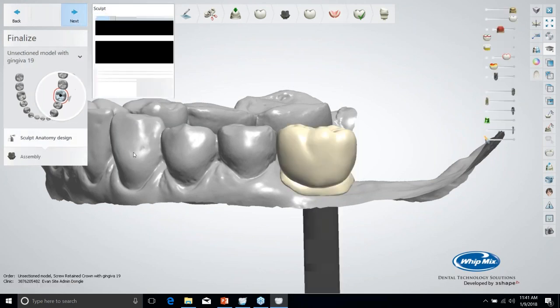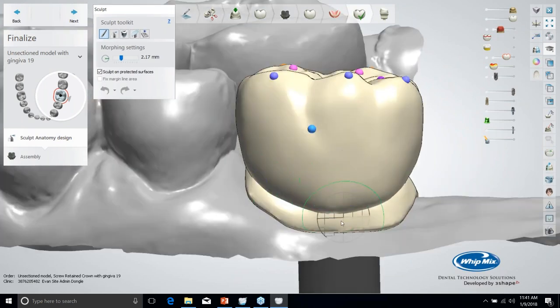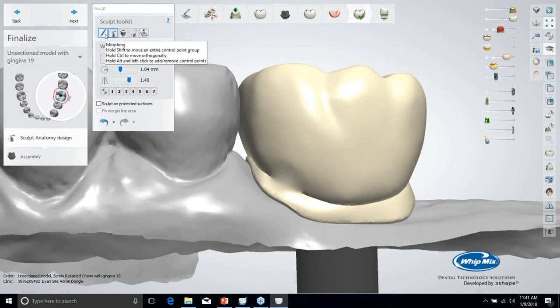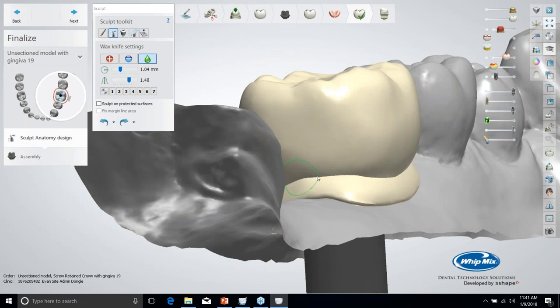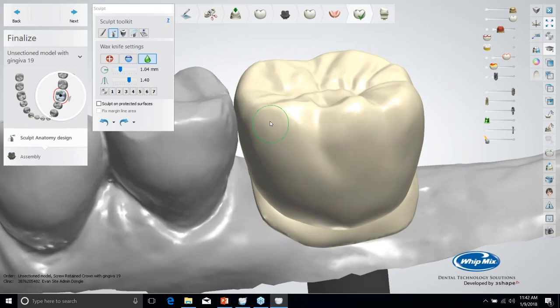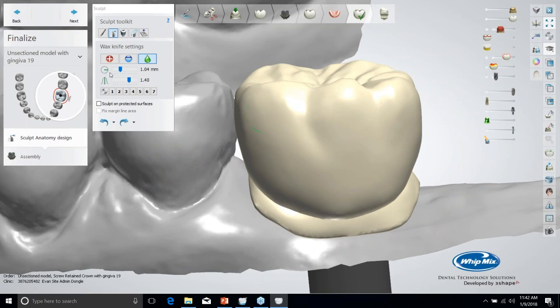I'll go next. So now I'm in the finalized stage. The finalized stage is put the crown and the tissue together. And I have one final sculpt and morphing stage. One thing to note though is that if you're sculpting around the cervical third of the tooth, be careful that you don't go over the junction of your tissue because it's going to wipe out any of that crisp detail line you got there. So generally I don't do much unless I notice I don't like a cusp here or something, make a little tweak to it, but generally you want to have most of your design done before you get to this stage.